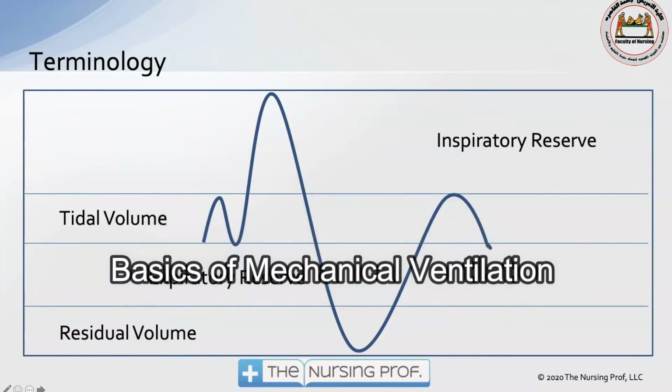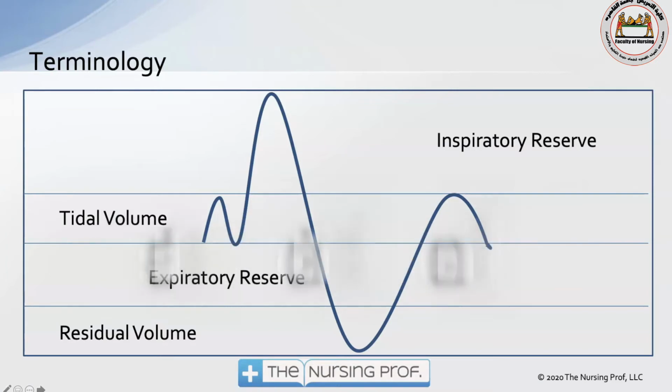Let's talk a little bit about the terminology that's used when we're talking about mechanical ventilation. So this diagram here will help us to hopefully be able to understand a little bit better what these different terms mean. So let's walk through what the diagram is first.